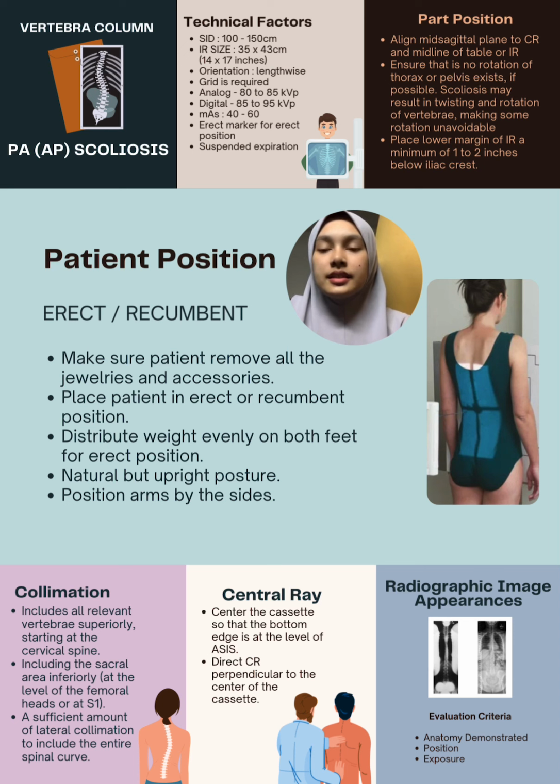When the patient is in erect position, the patient will stand upright with their back facing towards the X-ray tube and their face toward the image receptor. We need to make sure that the feet are shoulder width apart to provide stability and reduce the probability that the patient will lean.